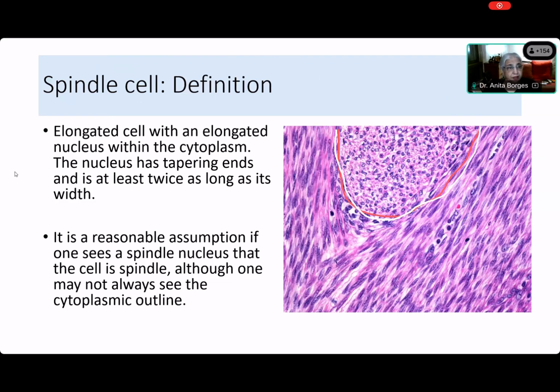So if I want to cut this fascicle transversely, let's try that experiment. If I cut it like this, what do you think it will look like, Shashank? What will those same cells which are spindly look like now? They will look round. Round, obviously, because I'm cutting something that is long transversely, so they will look round.